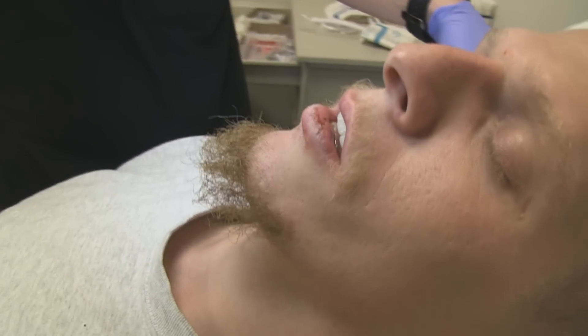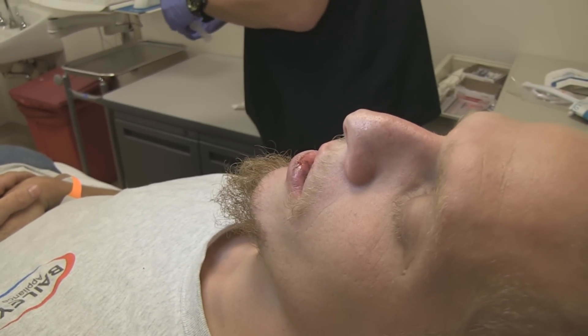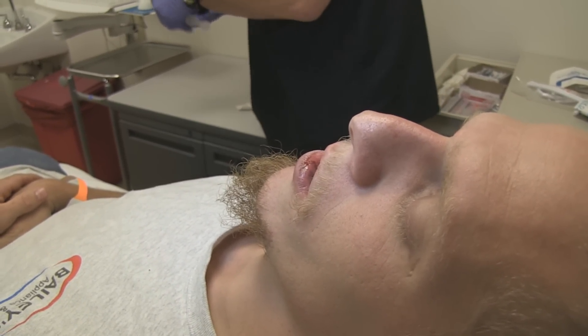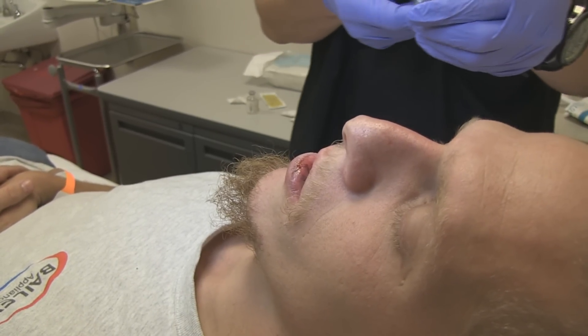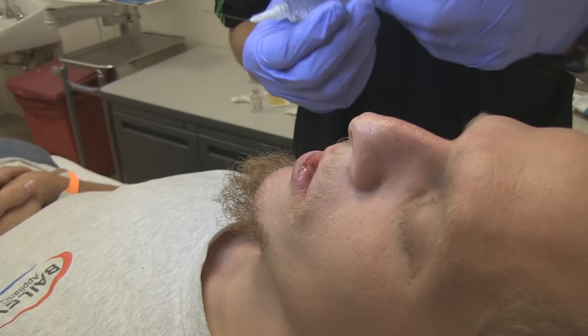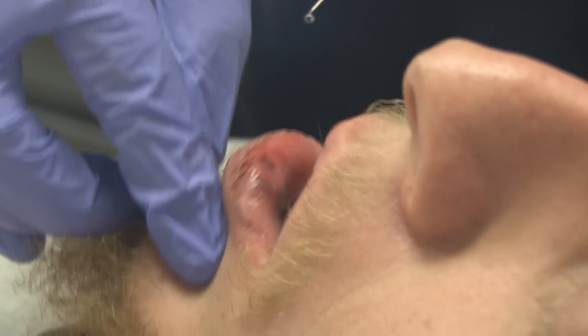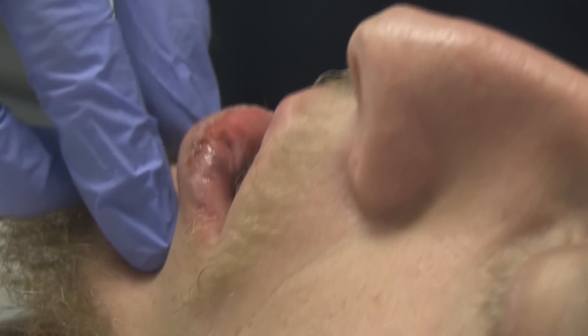In his case, the lip laceration. So what we're going to do is an intraoral approach — we're going to come down from the superior aspect. We're using a small 27-gauge needle here. I'm just going to palpate the foramen there.